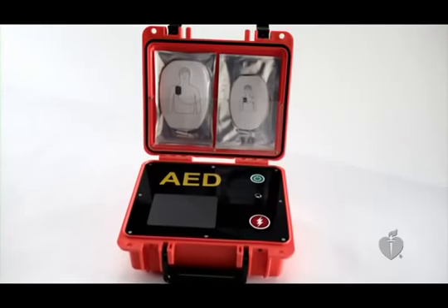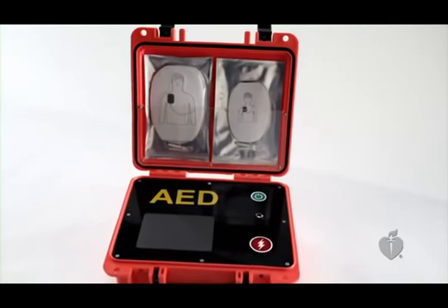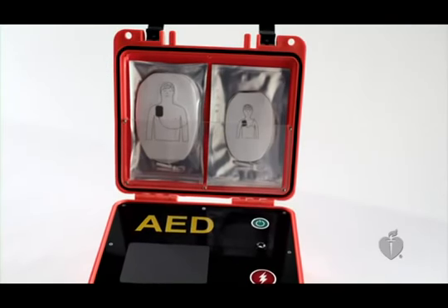Which feature is available depends on the type of AED you are using. If your AED includes a smaller size pad designed for children, use it. If not, use the standard pads, making sure they do not touch or overlap. The important thing is to be familiar with the AED you will be using, if possible, before you actually need to use it. When you are using an AED, remember to turn it on first and follow the prompts as it leads you through the rest of the steps.